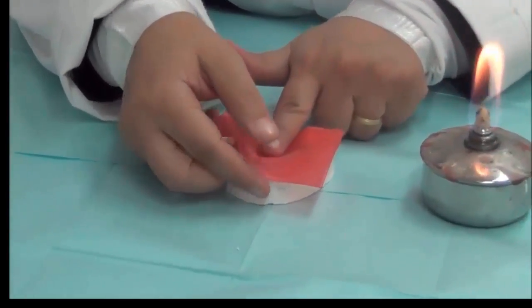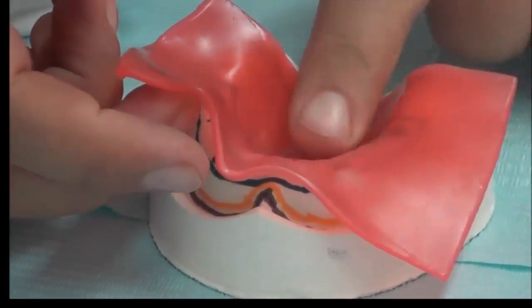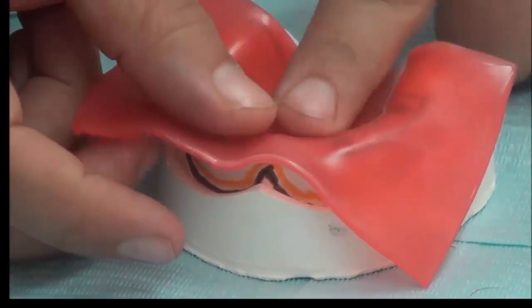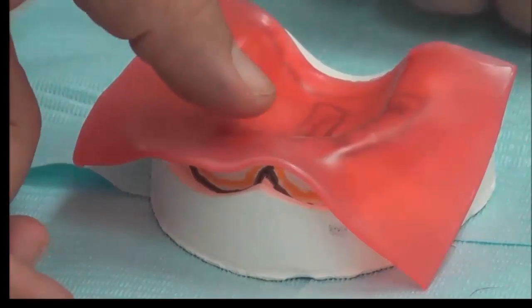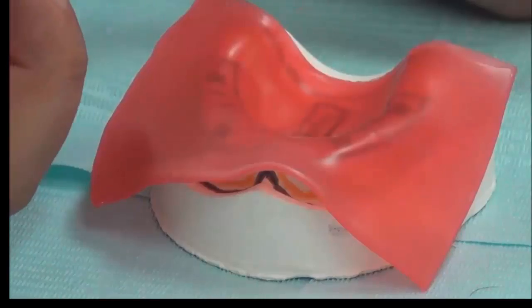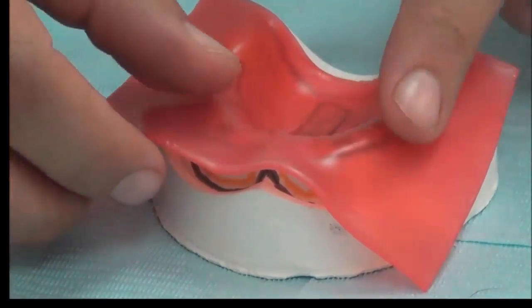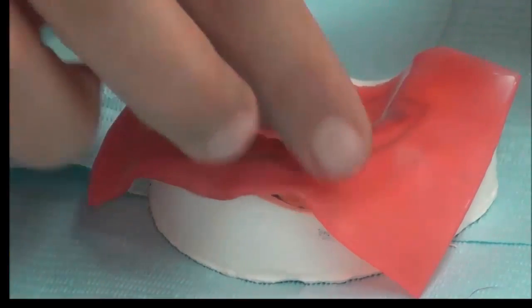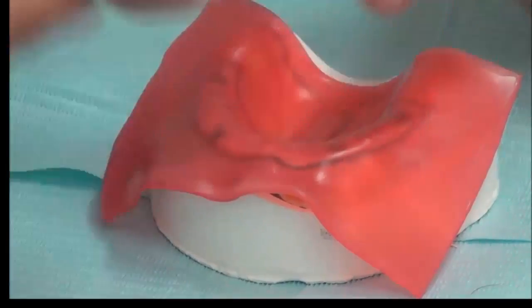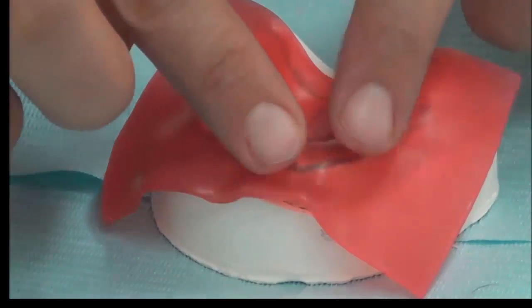We usually adapt from the middle first. Adaptation doesn't mean pressing. It's simply just shaping. So I don't press firmly on the wax, because if I press more, this wax will become thinned out and I lose the space that I need. So the adaptation means only shaping the wax into the shape of the cast. So it's now fully adapted to the cast without any extra pressure. The even thickness of the wax is maintained all around.